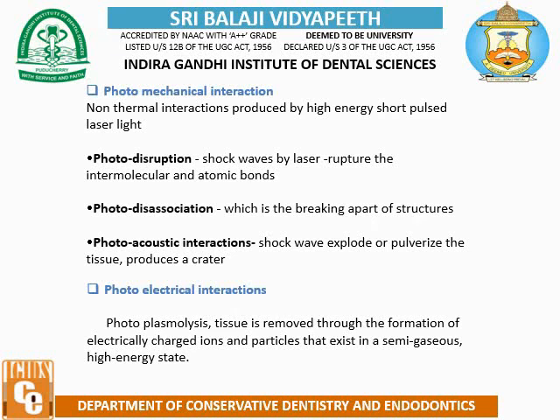Photomechanical interaction, a non-thermal interaction produced by high energy short pulsed laser light. Photodisruption, shock waves by laser rupture the intermolecular and atomic bonds. Photodissociation, which is the breaking apart of structure. Photoacoustic interaction, a shock wave explodes and pulverizes the tissue and produces a crater.